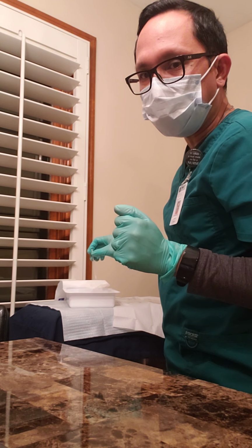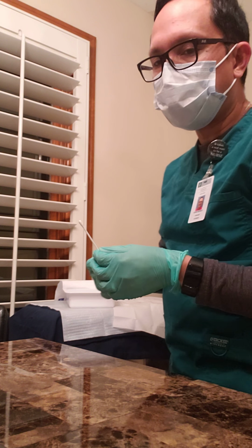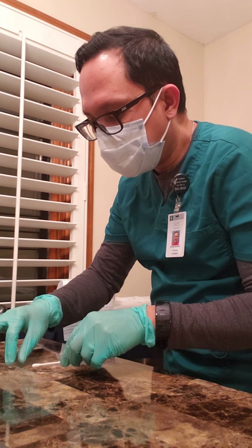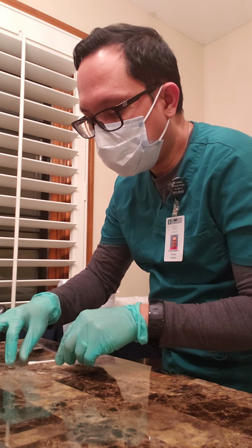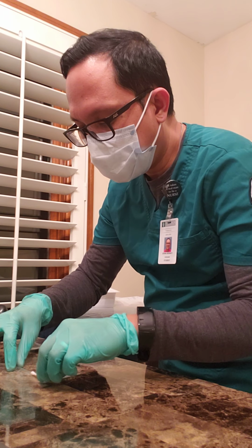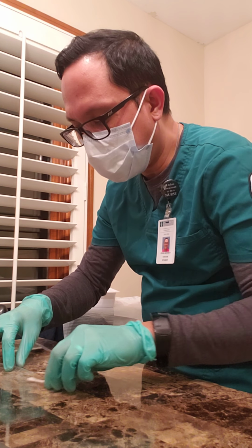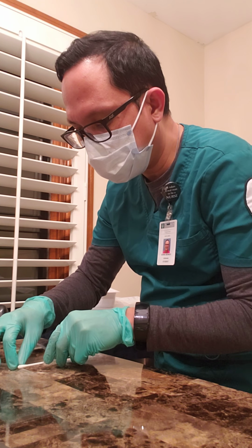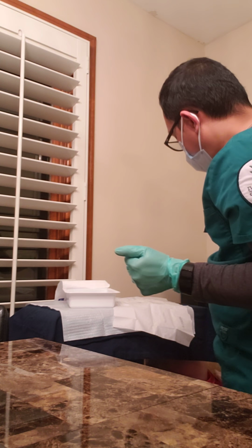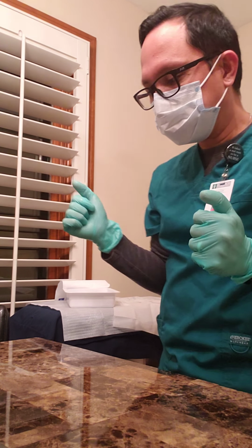After that, if you have betadine or povidone iodine, you're gonna go ahead and put some iodine on it as well. In the same manner, you're gonna go in a circular motion under the line from the inside out. And you can also put some iodine on top of the line, just to where you're gonna be covering it with the dressing. After that, you're gonna let it dry for 30 seconds again.